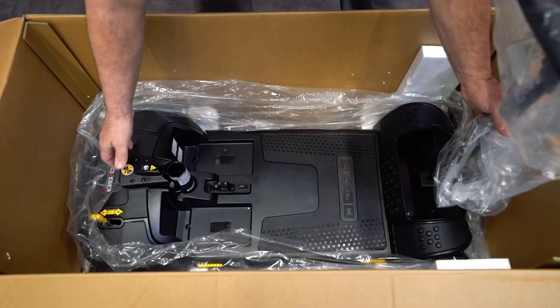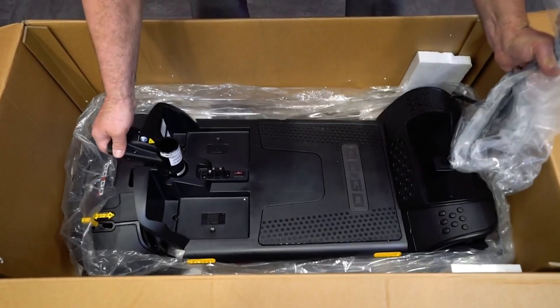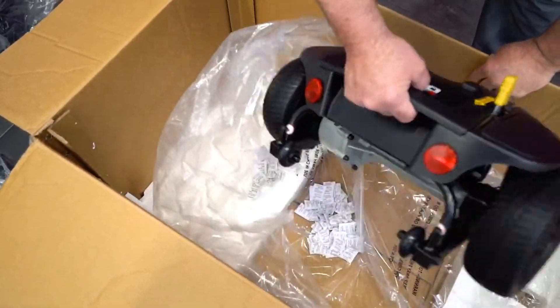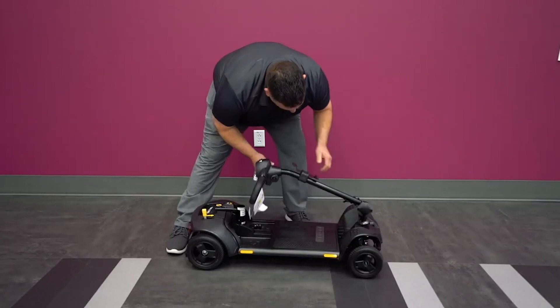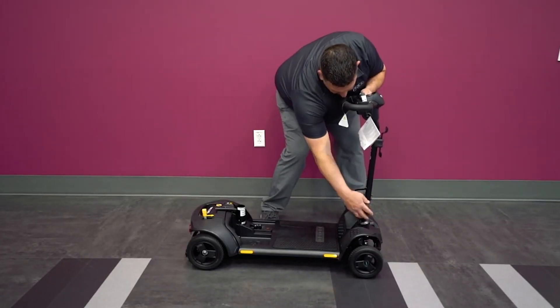Next, grip the tiller and the tab just behind the seat post. Lift up and the front part of the base will separate from the back, then simply remove the back. You should have the following contents. Use the knob to ensure the tiller is loosened, then move it into an upright position and secure the tiller.